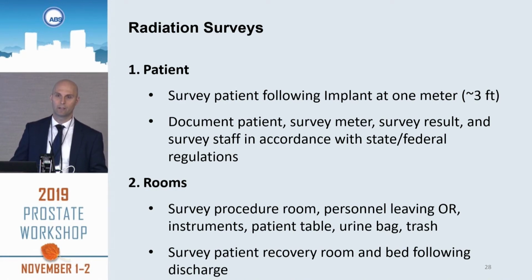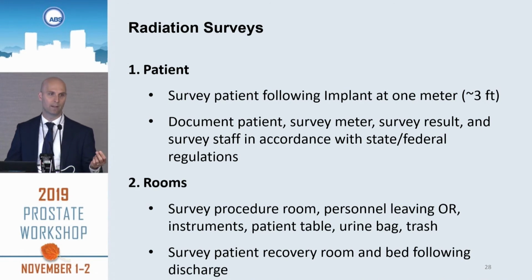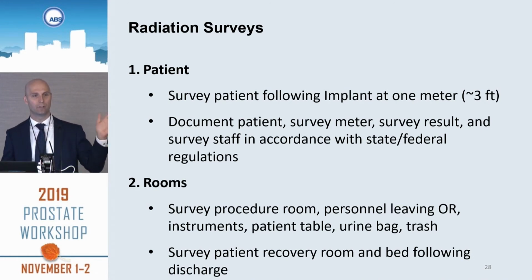In particular, we had an instance where we cut a strand in the OR, and a seed fell out of the back end onto the floor and rolled under the table. It was the old Vicryl sutures, and it was a little hard to distinguish seeds and spacers. So it was caught during the survey of the room as opposed to the inventory. I strongly recommend that you survey anywhere the seeds might have been, and the carrier itself, any of the trash, such as the dressings or the parts from sterilization, survey the floor, and survey staff who leave the room.